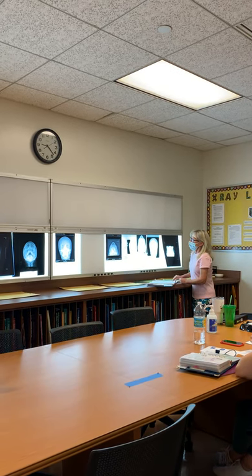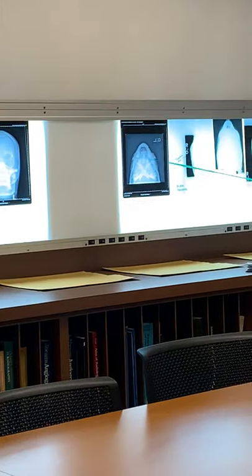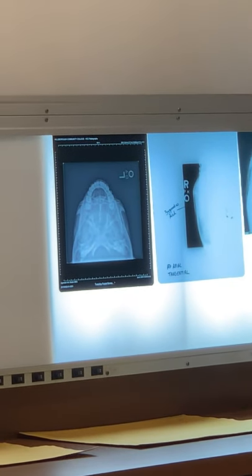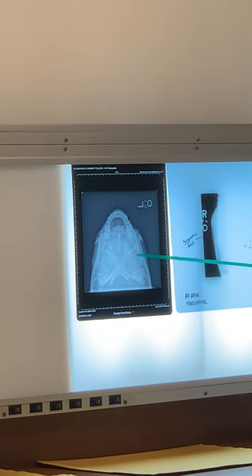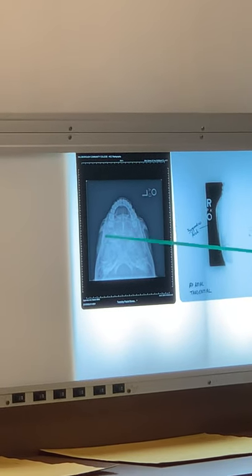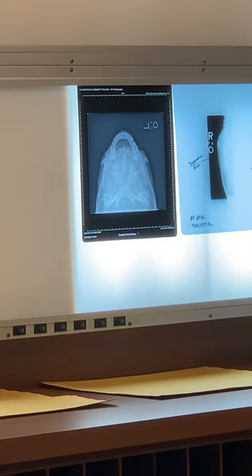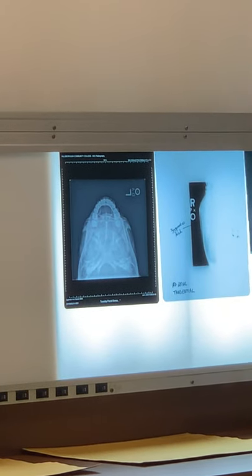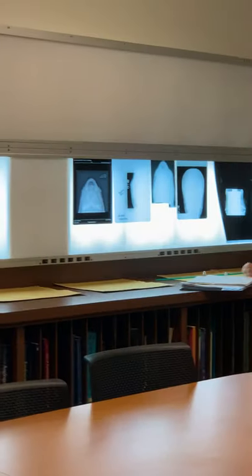Okay. So let's look at this one. Which one do you see? I mean, this is picture perfect practically, but which one do you see a little bit more popped out? The right or the left? The right one. There's a little more space in the right one than the left. But let's say you didn't see the left at all. You saw all that on the right. What would you go back and do? Turn to the left. Turn to the left a little bit. Good. Okay. Do you all get that? All right. Turn the page for the next one.